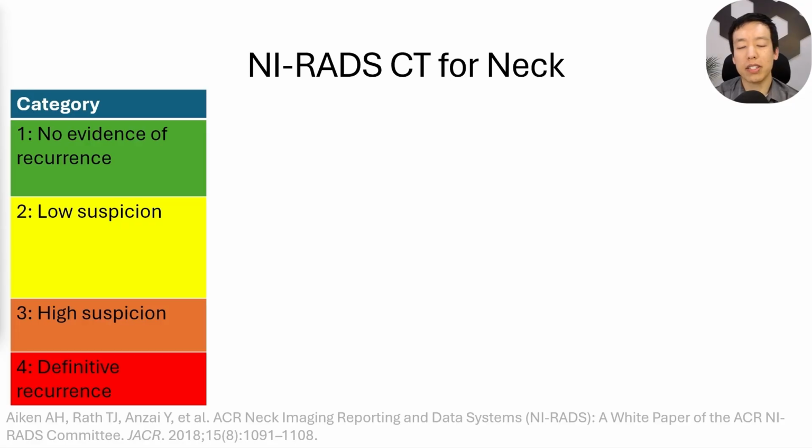The goal of NI-RADS is to improve communication between radiologists and referring clinicians, as well as provide structured management recommendations based on imaging results. I routinely use NI-RADS in my practice and find it's really helpful in ensuring that my reports are clear and actionable rather than vague and non-committal.